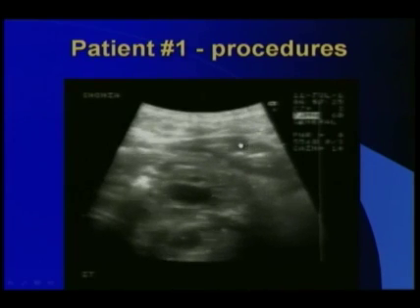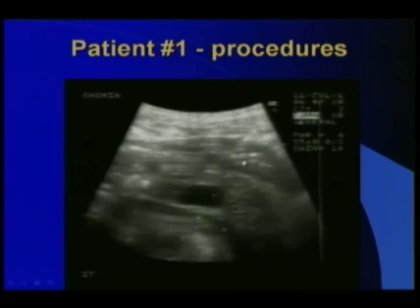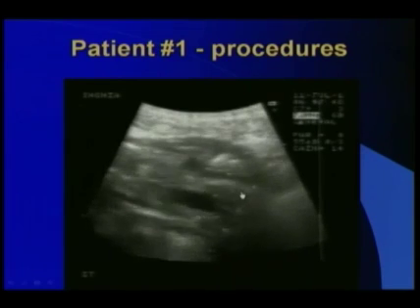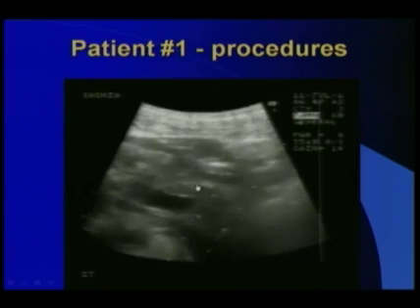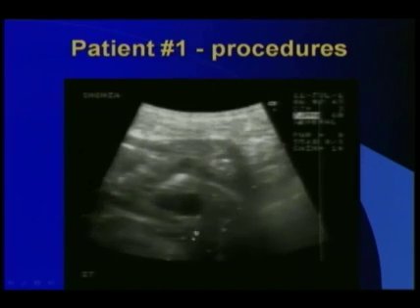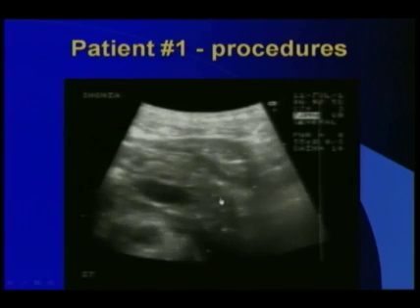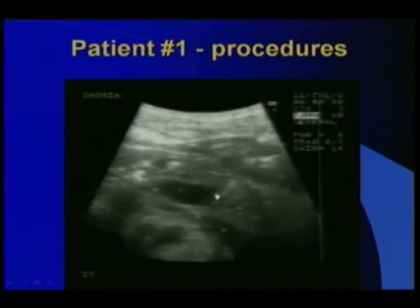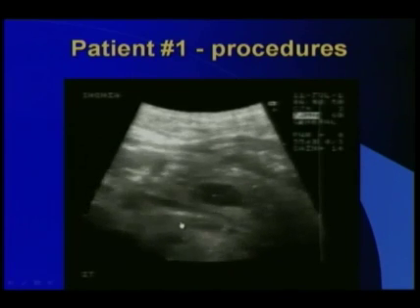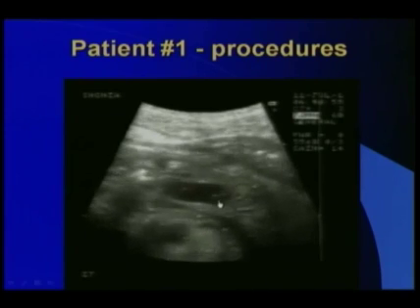wirsungostomy. You see here the anterior and posterior walls of stomach, and this is our puncture needle. By the way, the stomach creates the problem for puncture, causing the change of direction of the needle. You see how the needle changed the direction. This is the needle guide, and it's out of this trace. So we needed to withdraw the needle and to perform it a second, or probably third time also. This is the tip of the needle.